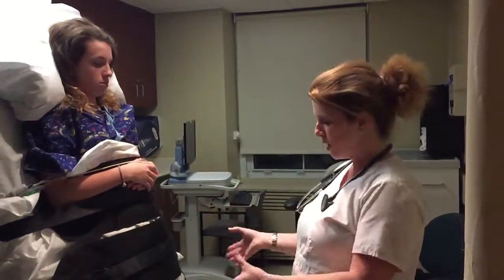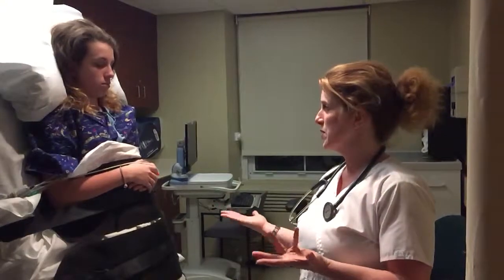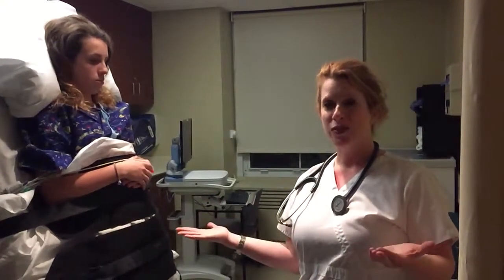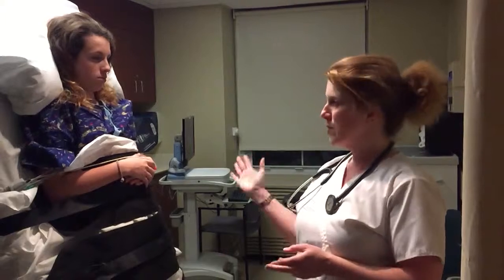A carotid massage also stimulates the vagus nerve, and we're looking for that dilation of the blood vessels again to see if it produces a syncopal episode. If there is a syncopal episode anytime during the procedure, it's over, and it's considered a positive test. If the 40 minutes has gone by and there's no syncopal episode, it's considered a negative test.